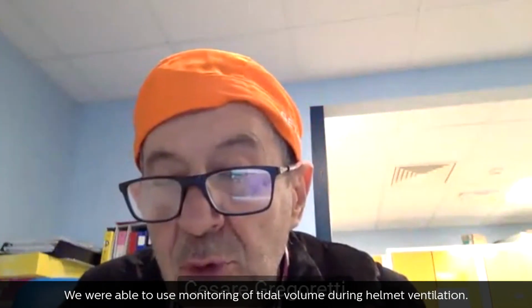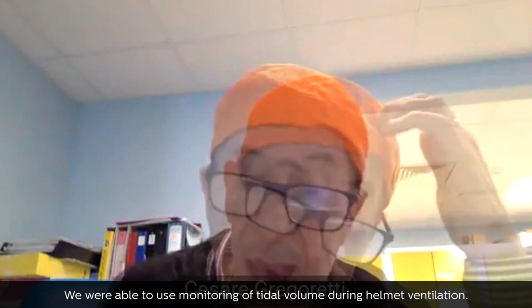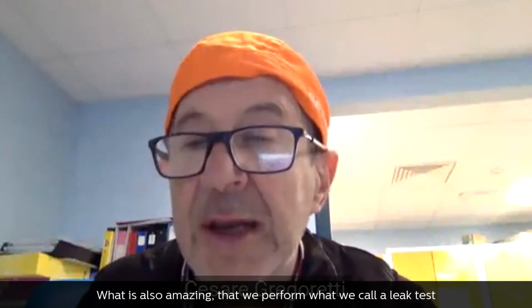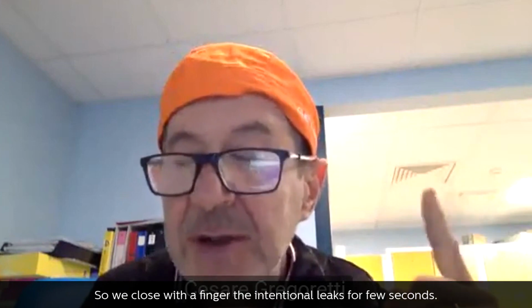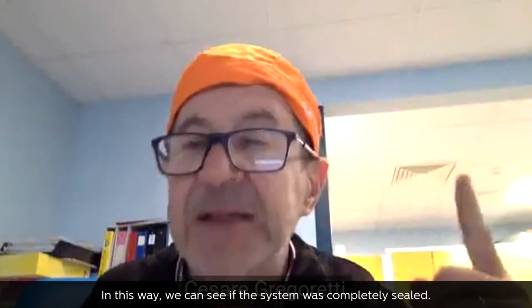We were able to use monitoring of tidal volume during helmet ventilation anytime. What is also amazing is that we perform what we call a leak test at the very beginning of the ventilation. So we close the intentional leaks with a finger for a few seconds, and in this way, we can see if the system was completely sealed.